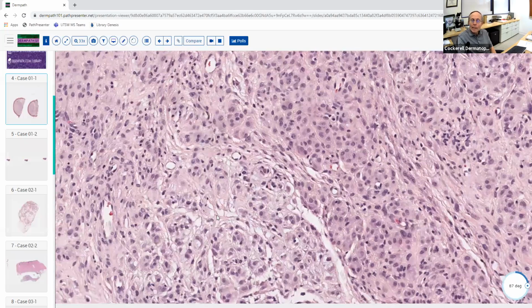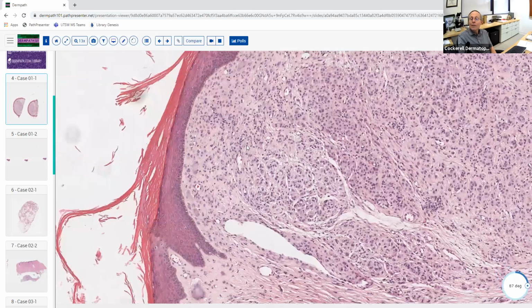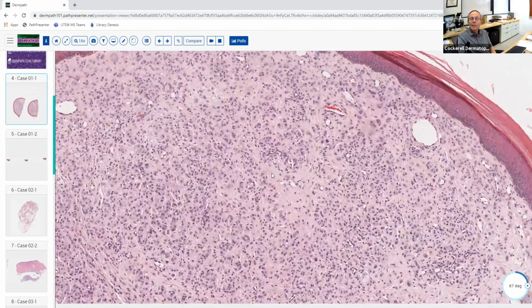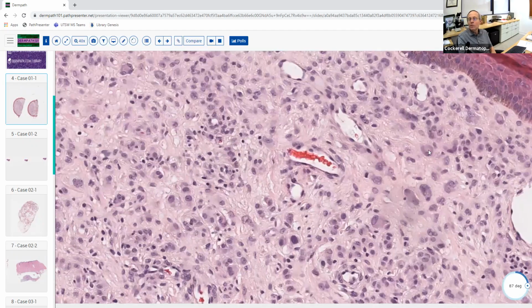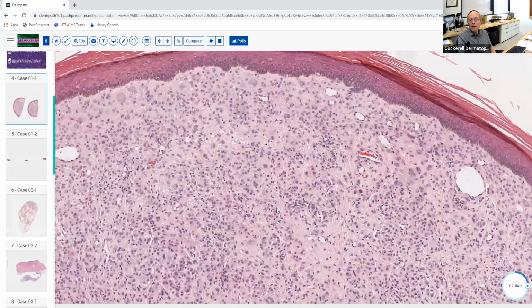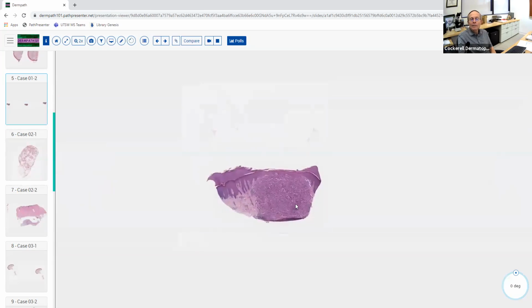If you get them early, they may have a lot of inflammation and histiocytes and eosinophils, and you don't really see any Touton giant cells when they're really early. But later in life, when they sit around for a little longer, they actually get more Touton giant cells. This is probably kind of a teenage version of it. It doesn't have as many Touton giant cells as they often have, but you can still make the diagnosis. Okay. Now there's an entity that's in the differential diagnosis of that.